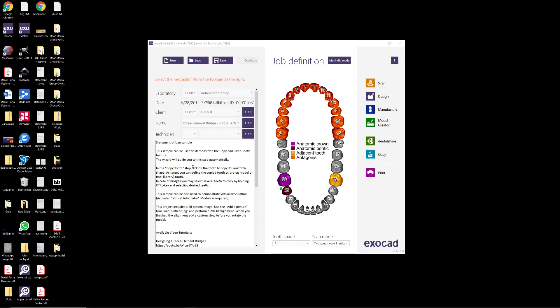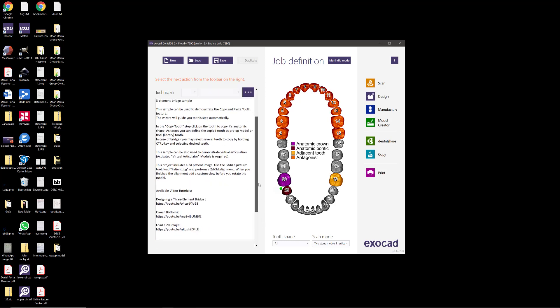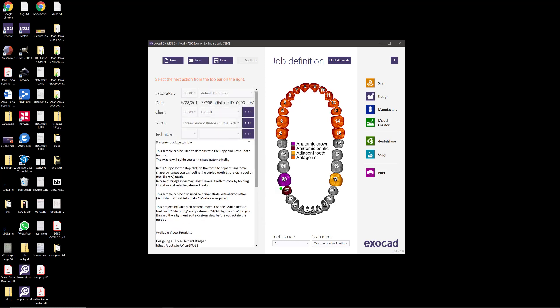This time I'm going to show how to add an extra tooth to an existing design without having to start over. To show this, I'm going to use the demo case for the three-element bridge and we'll just jump right into the design.